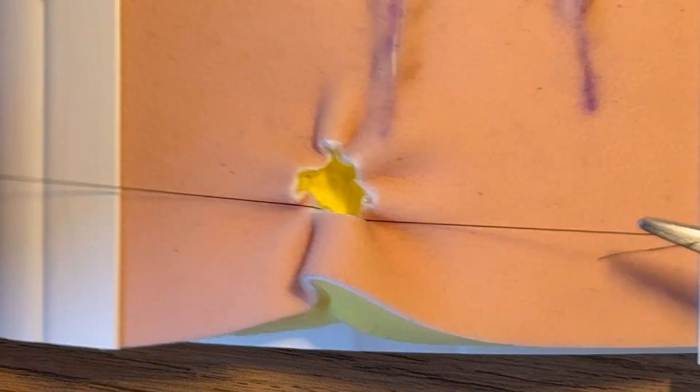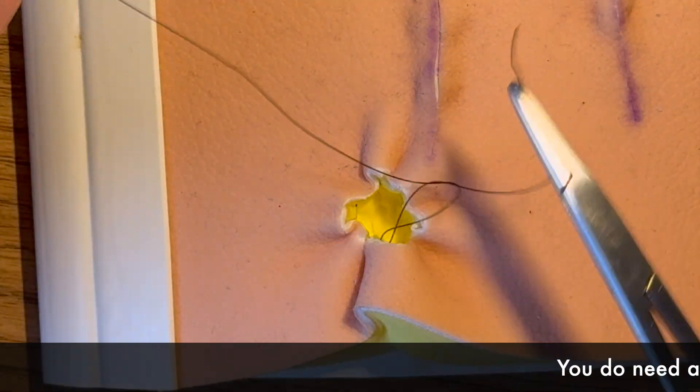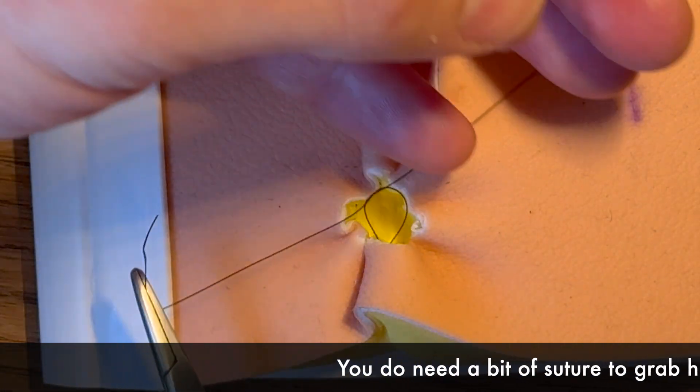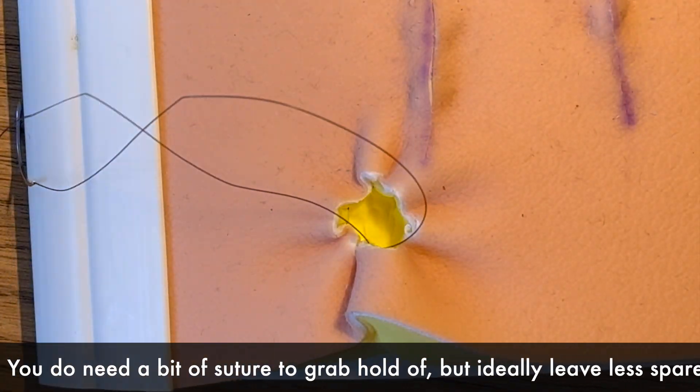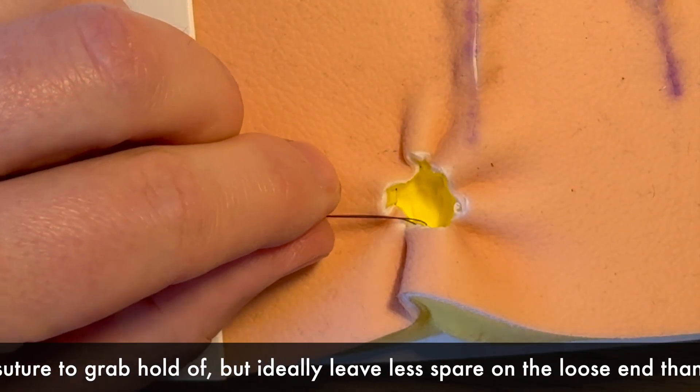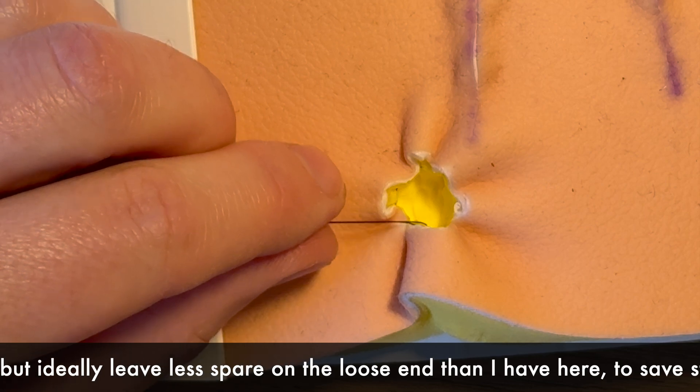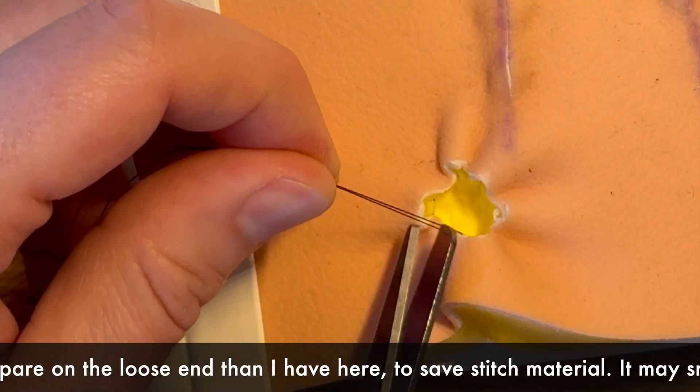So we're going to take that like that and you pull it like that, quit while you're ahead, slip it down and that's going to hold in place. Then you finish it off. I've left far too much thread on here just for demonstration purposes. You make it shorter in real life so you're not wasting loads of thread.